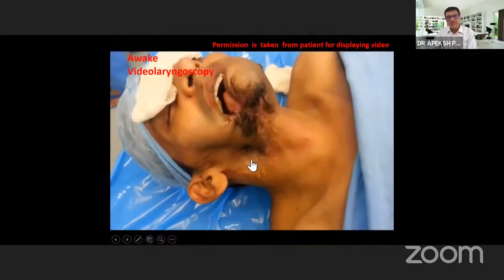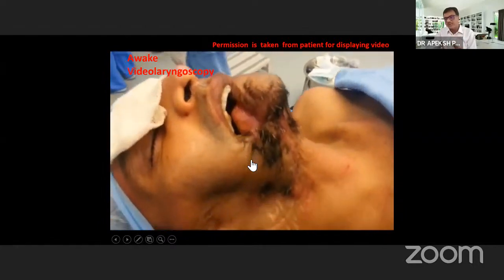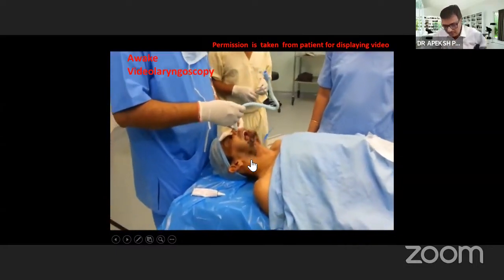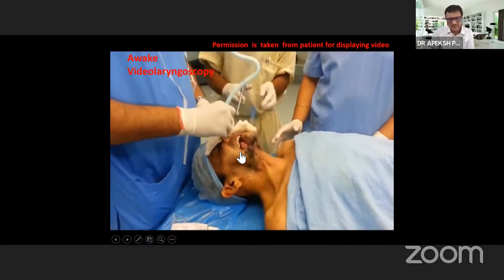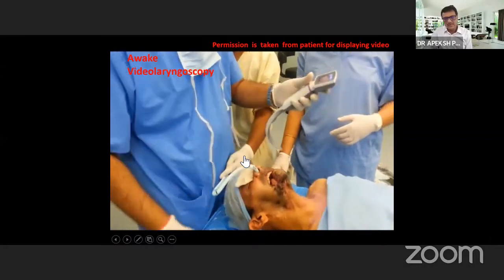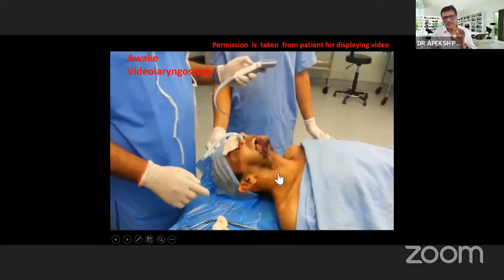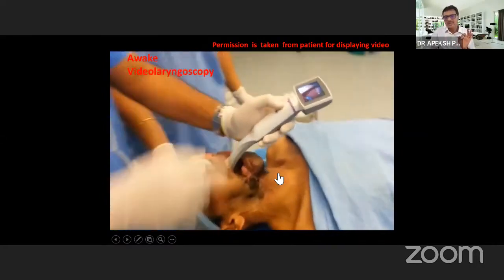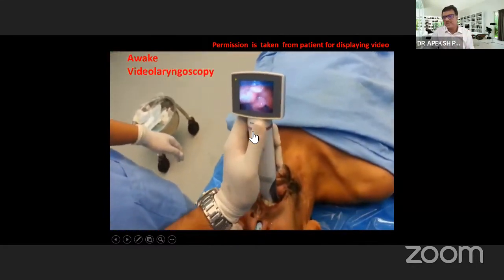This is one of the videos of performing awake intubation in a post-hemimandibulectomy case for redo surgery. It's a nasotracheal intubation. We have used the non-channel video laryngoscope blade, passing a tube to the nasopharynx and asking the patient to open the mouth. We have given bilateral superior laryngeal nerve block and transcricoid spray. And look, I'm not giving any force. Able to see the vocal cord and epiglottis.